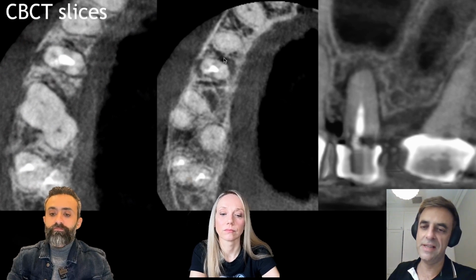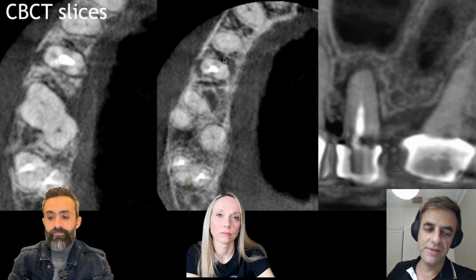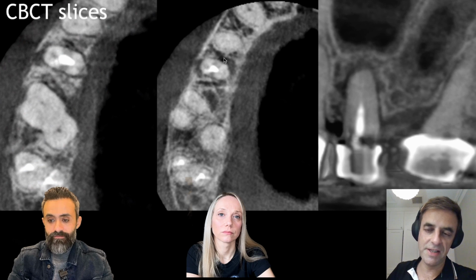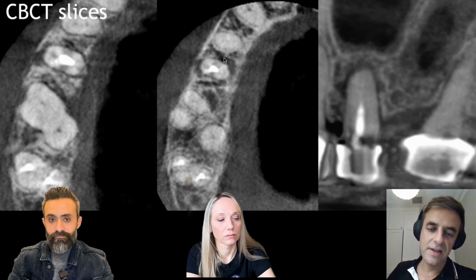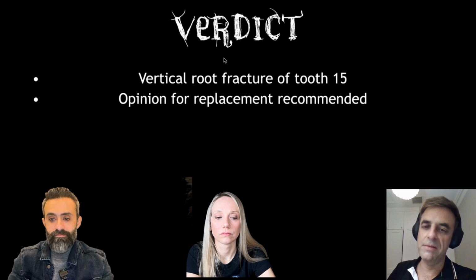The other thing that CBCT does, which shows really nicely, is that sometimes you'll have apical into middle fractures in teeth, and you'll just look at them and go, oh. There's no cervical bone defect because the cervical part of the tooth hasn't cracked. It's the apical and middle sections. Quite often it happens in lower molar teeth with thinned out inner curves where the root's been thinned out by preparation. Because again, some of our instruments tend to be a bit bigger than we want in those areas, and really those microanatomy, if it gets weakened, then it will fracture through there eventually.